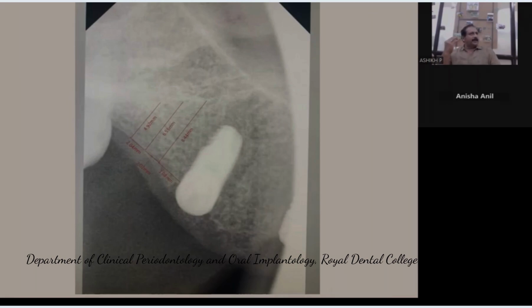Whatever the sinus has been left will be filled with bone graft on top if it is beyond 2 millimeters. Beyond 2 millimeters has to be grafted with bone. So if you get around 3 or 4 millimeters as required from here, you need to place bone graft there. So slowly, the implant will push the Schneiderian membrane up with the necessary bone grafting in the apical area, and it should be comfortably flushing with the crestal bone region. All right? And then needed suture.